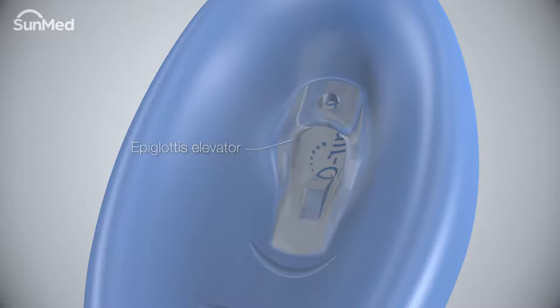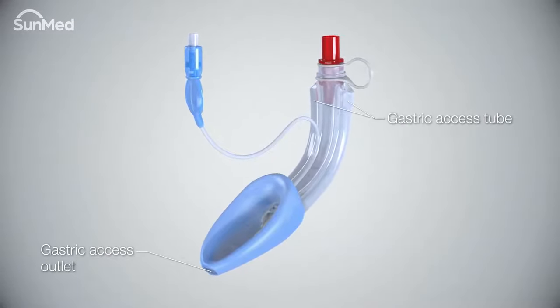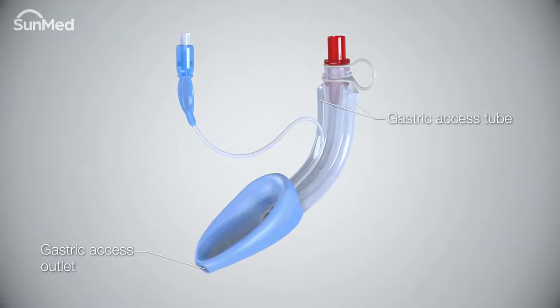The safety hole provides gas exchange if the main tube becomes occluded. The air Q3 gastric airway has a channel on each side of the tube which enables gastric access.